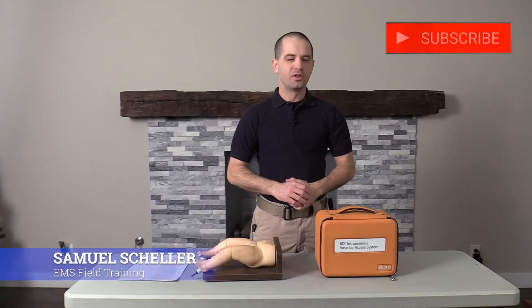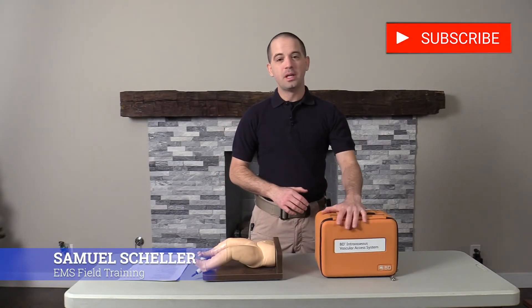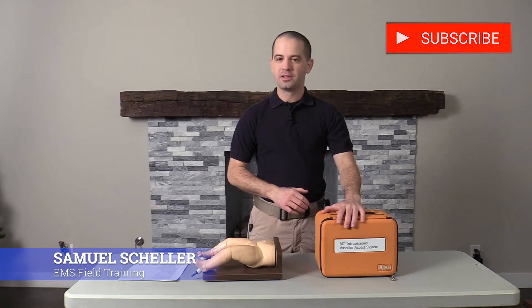My name is Sam Scheller from EMS Field Training, and today we're talking about the BD Intraosseous Vascular System.